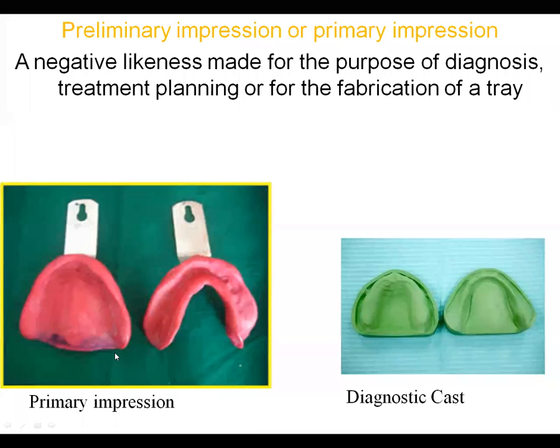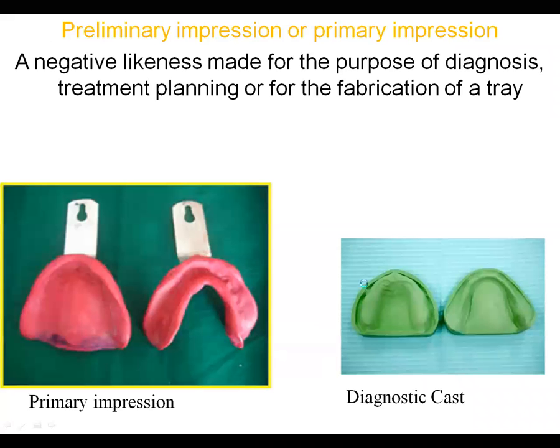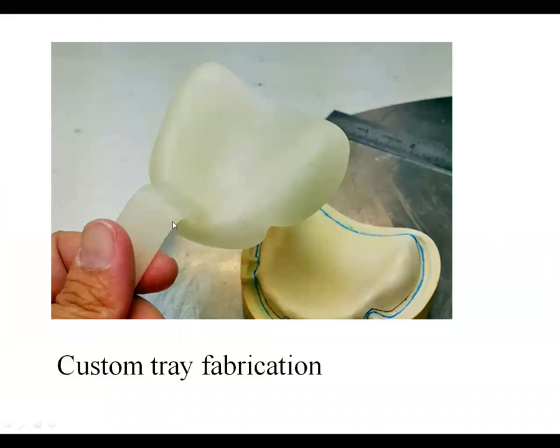And the second most important use for this diagnostic cast is fabrication of your custom tray. Now, on this diagnostic cast, we fabricate a fine custom tray. Here this diagnostic cast is covered with spacer wax.